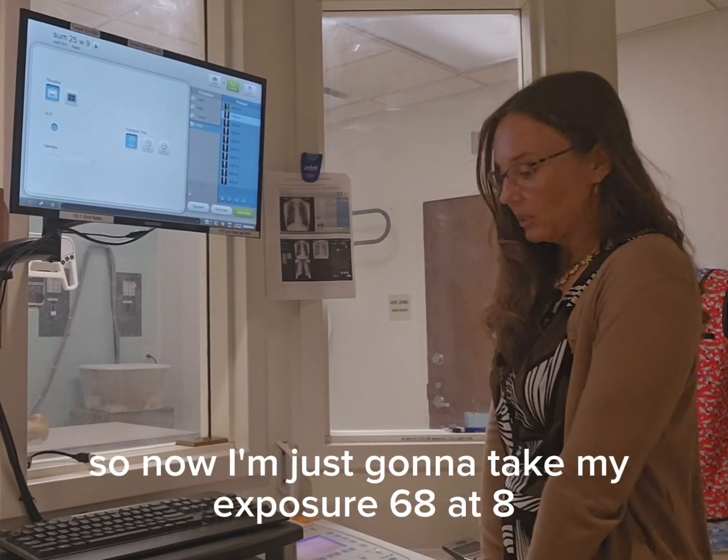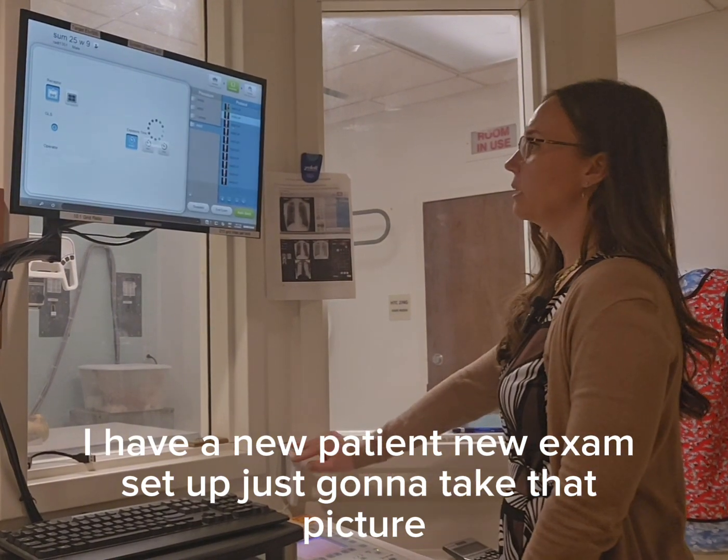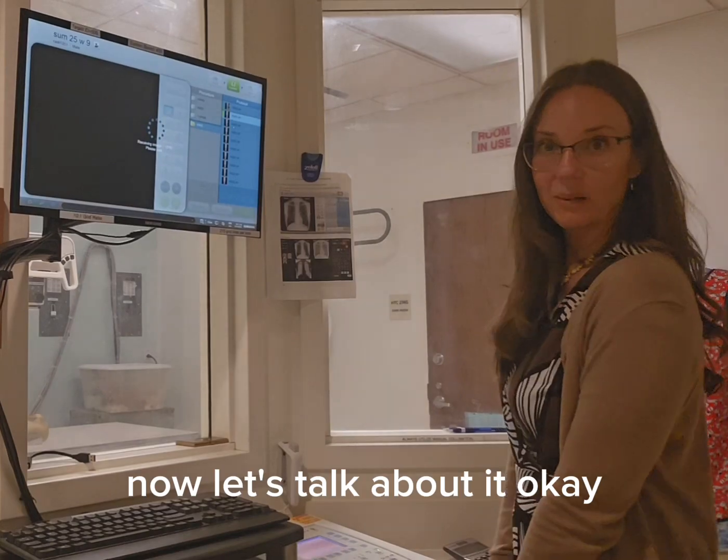So now I'm just going to take my exposure, 68 at 8. I have a new patient, new exam set up. I'm going to take that picture. And now let's talk about it.